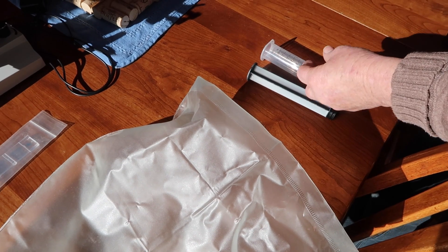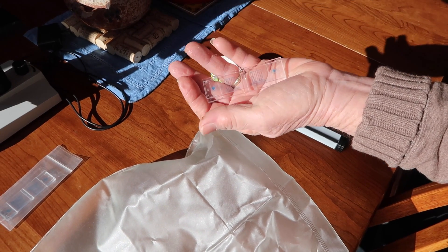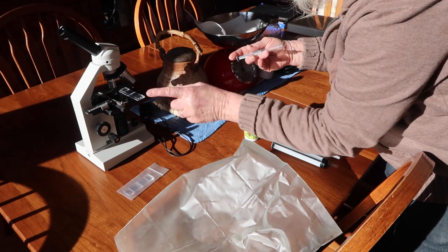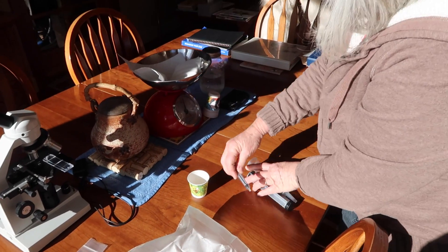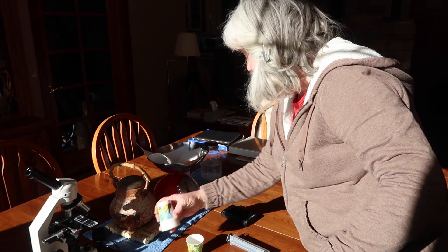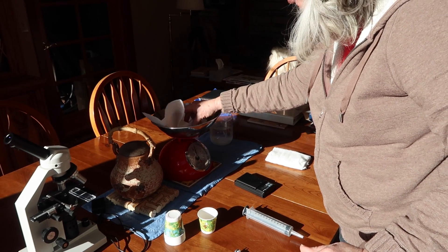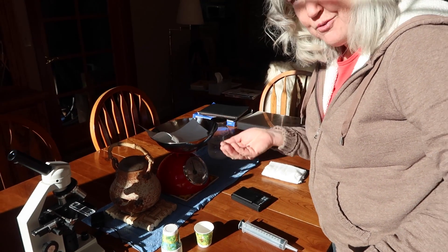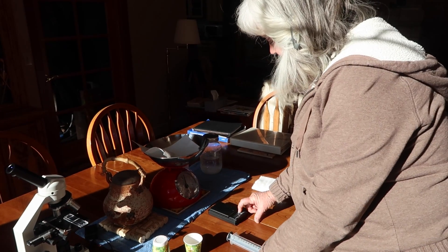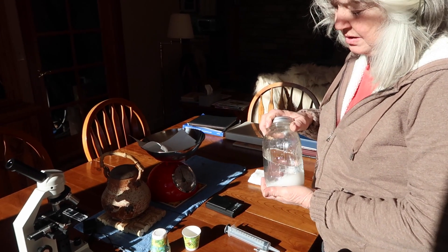How we load it is: we're going to make our sample, do some things to prepare it, and then I'm going to aspirate about two cc's in here and just go like that — the liquid goes in there. The things we need are a small measuring syringe, a larger measuring container, something to put the sample in, something to filter the sample with — this is cheesecloth — and something to measure out the right amount. And then flotation liquid.